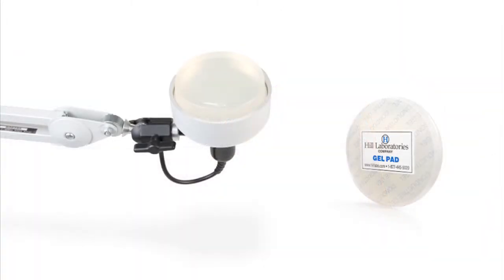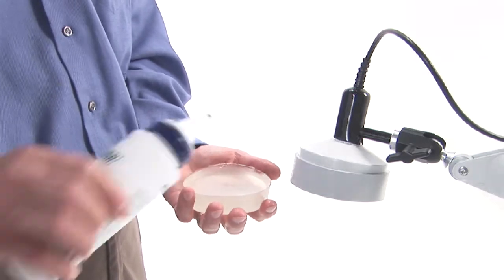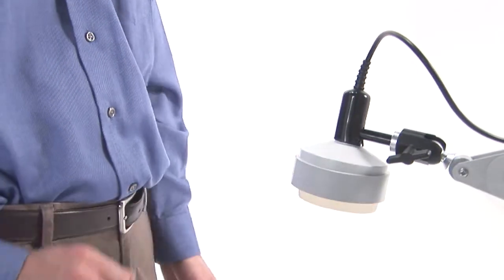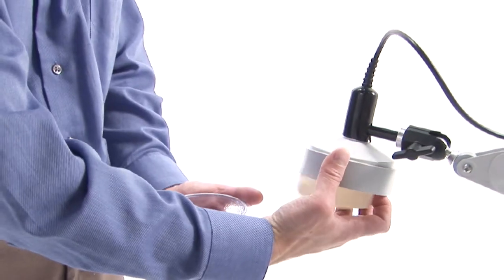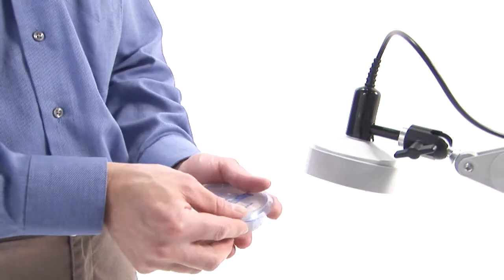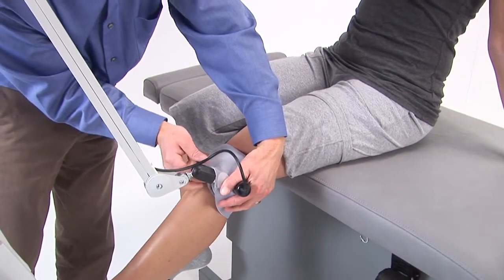The hands-free ultrasound uses a special coupling agent called a gel pad, which contours to the patient's body. Applying liquid ultrasound to both sides of the gel pad will ensure proper contact and maximize transmission of ultrasound into the body. The retainer ring prevents the gel pad from slipping off during treatment. After a treatment, the gel pad can be cleaned with a 10 to 20 percent alcohol-to-water solution. Keeping the gel pad moist with water will prolong its lifespan.